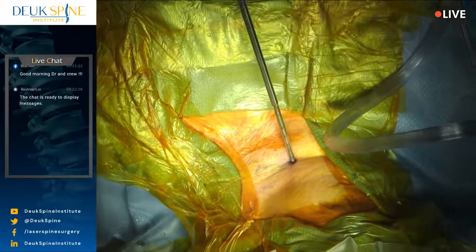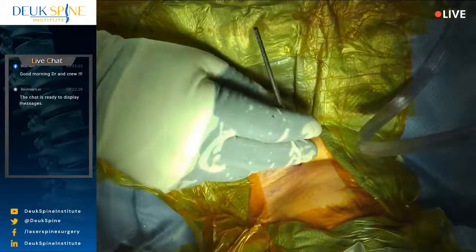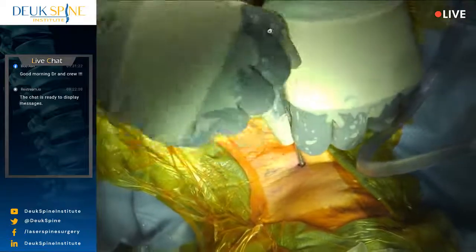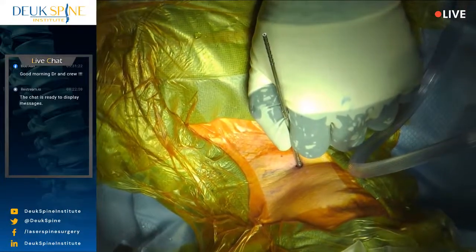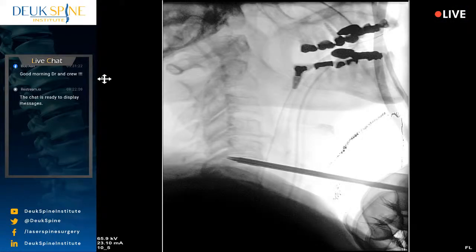All right, that's as far as I can get it right now. We're going to start removing the herniation, and we're going to advance the tube a little bit more as we go along. Let's see, shot. So once again, we have to use the x-ray machine. Do you have a way to remove it? We have to use the x-ray machine to guide ourselves here because we're using metal instruments so we can see it on the x-ray.